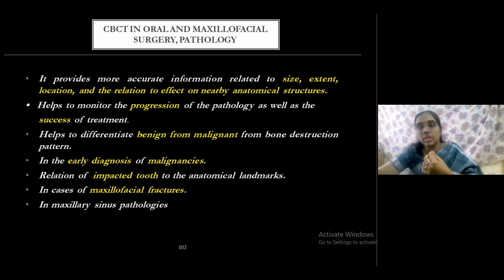If you take an IOPA and come across some bone loss which is not very specific of periodontitis, and you suspect it could be a malignant lesion, CBCT helps in early diagnosis. Of course, it also shows the position and the relationship of the impacted tooth, and is used in cases of maxillofacial fractures. So these are the wide applications of CBCT in surgeries and pathology.